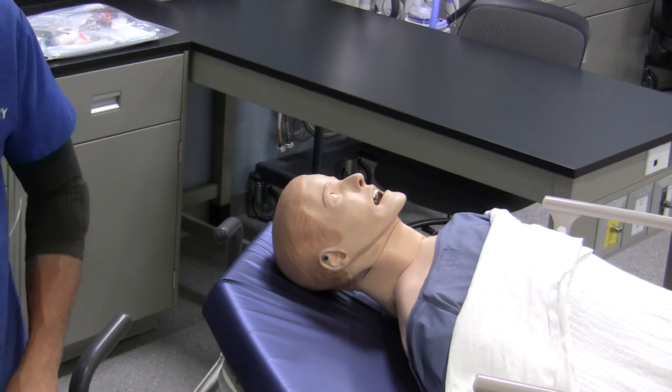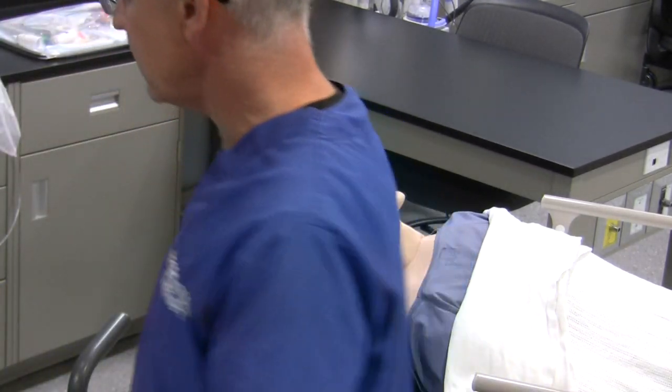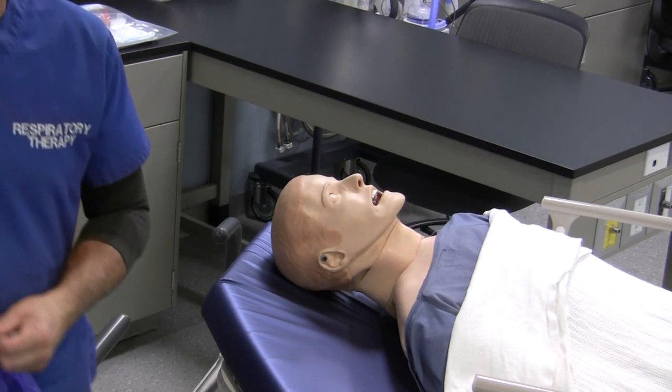When working in a patient care environment, make sure you use proper personal protective equipment first. Wash your hands before touching the patient. You should be wearing safety glasses, a mask or mask with face shield, and gloves for sure. A gown may also be required depending on the situation — PPE protects both you and the patient.